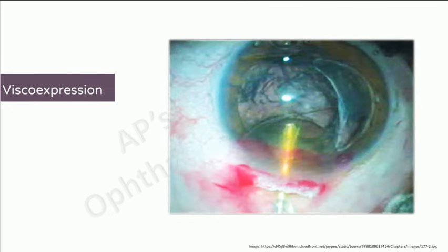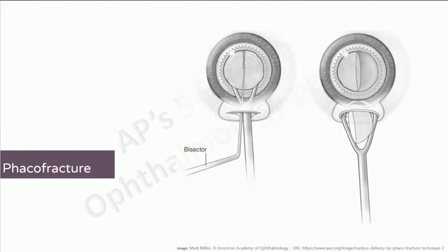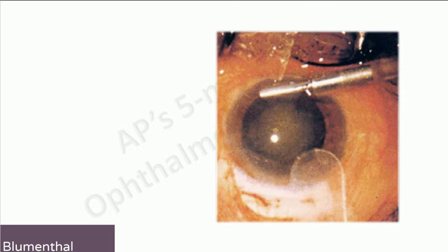In viscoexpression, viscoelastic is injected continuously into the anterior chamber instead of BSS. As the name suggests, the nucleus is sandwiched between a vectis below and another instrument such as an iris repositor or a Sinskey hook above. In phaco fracture, various instruments are used to divide the nucleus into two or more pieces to aid easy removal. In this technique, a 26 gauge needle is used to engage the nucleus and remove it. The Blumenthal technique makes use of an anterior chamber maintainer to maintain a positive pressure in the anterior chamber and a sheets glide to remove the nucleus.